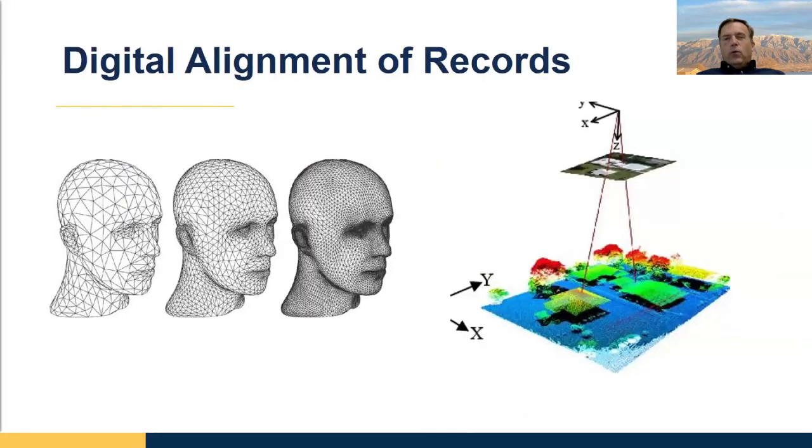Any of you that have been to any of my courses on digital have probably seen this slide. I'm going to try to focus it on dentures at this point. But as we're getting more and more into the digital world, you'll find that file alignment is very, very important. What I mean by that is that there are some fundamental skills in the analog world. Like if you're going to make a model, you've got to know how to mix the model, how long it's got to set, use good quality stone, all that stuff. It creates invisible problems. If you don't do it, your things won't fit and you don't know why.